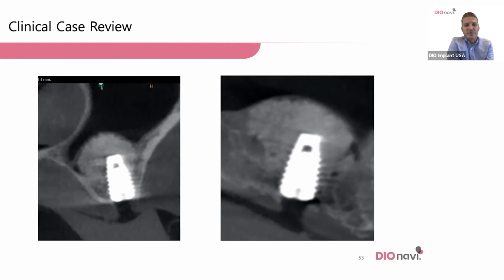Again, that's a clinical case that I appreciate in terms of my contribution to it. The workflow for me is awesome. For the patient to have a service like that is just phenomenal as well. They're always really impressed, if they're not sedated, by how quick these procedures go. They're expecting some big extended surgery, and that's just not necessarily what implant surgery is today. There can be cases where it's like that, but under the right circumstances, these are pretty straightforward.